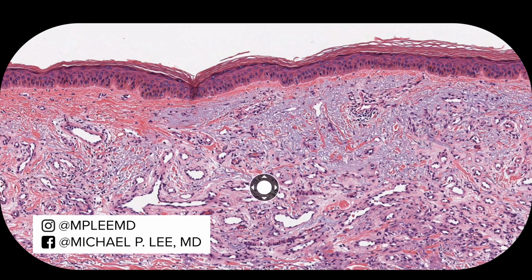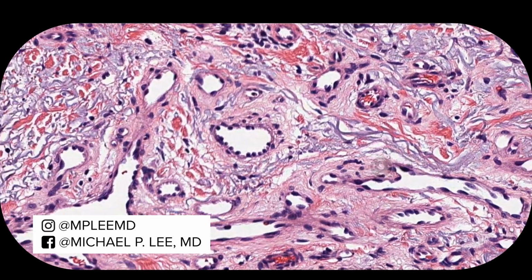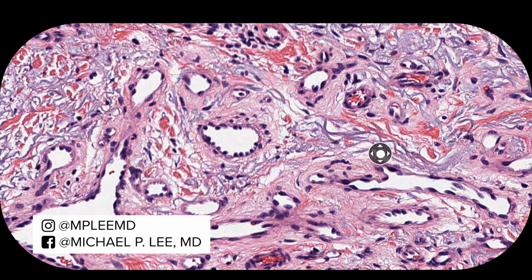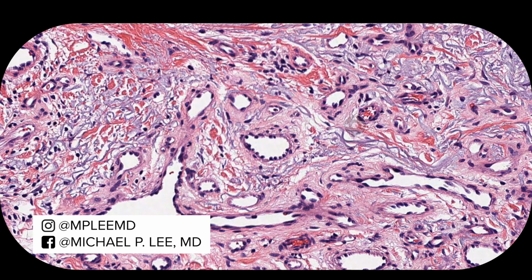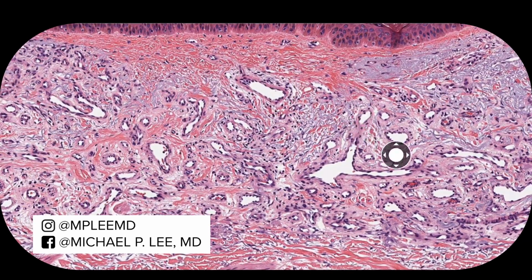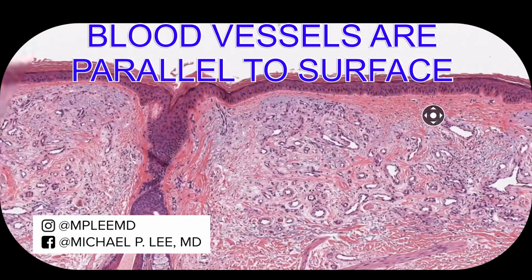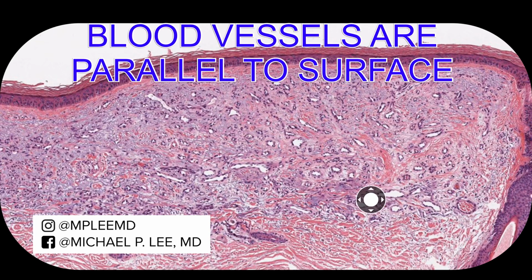So that's what we're looking at. You can see here, these cleared out spaces are actually blood vessels, and here you have your endothelial cells, which are the cells that make up the blood vessel. Some of them are protruding out and look kind of plump, but there's really no significant atypia. As you're looking at these blood vessels, some of them are oriented parallel to the epidermis. It's kind of harder to make out in this section, but you have some parallel to the epidermis. That's characteristic of this lesion.